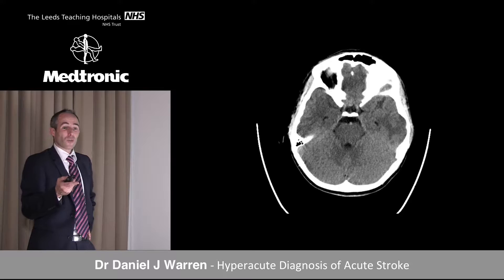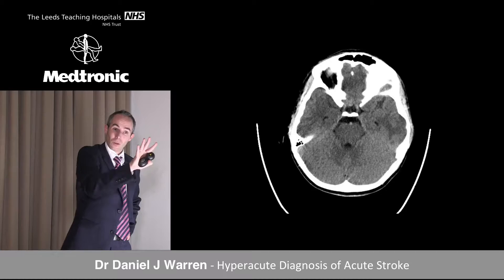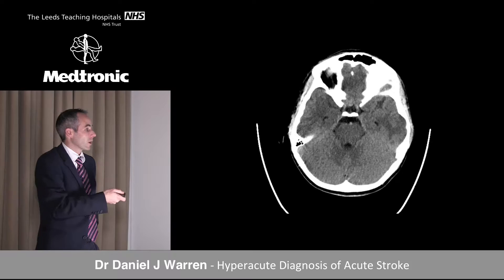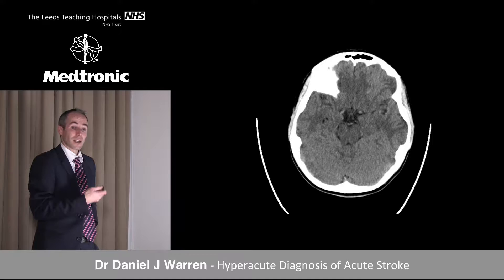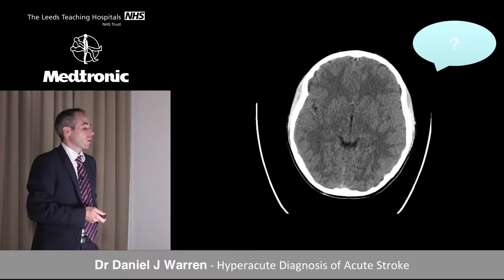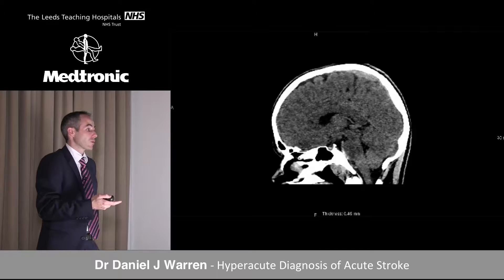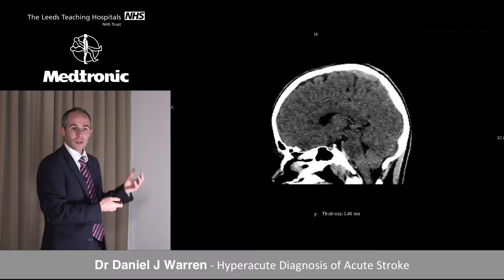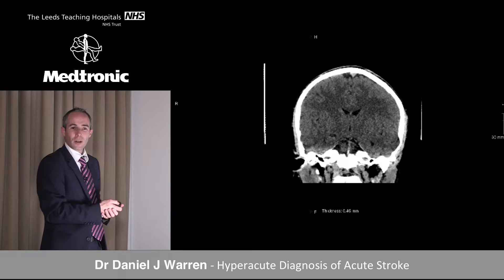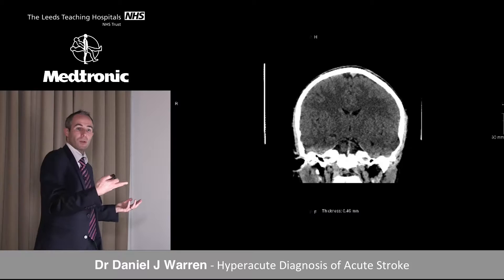Here's the basilar artery tip, with the distal internal carotid arteries for reference. As the vessel bifurcates into the PCA it looks normal. However, there is possibly abnormal attenuation in the basilar. Volumetric reconstruction lends strength to the perception of increased attenuation — bright signal within the inferior aspects of the basilar. In another plane, we're fairly sure this looks real.